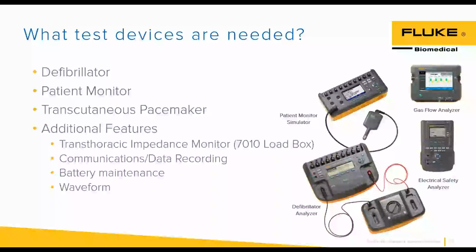So believe it or not, we might even need to bring an oscilloscope out of the closet. We haven't used those probably in a while. Might have to take a little bit to figure out how to set them up. But you might also need an oscilloscope to look at the waveform, especially if you're trying to troubleshoot one of these defibs or look at that waveform. Sorry, man, I just had to toss that one in there. I love my oscilloscope. I missed that one, so.